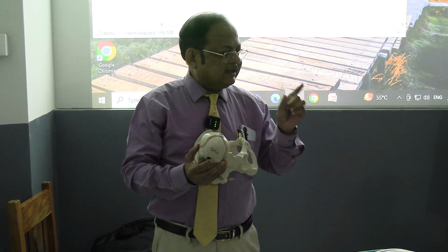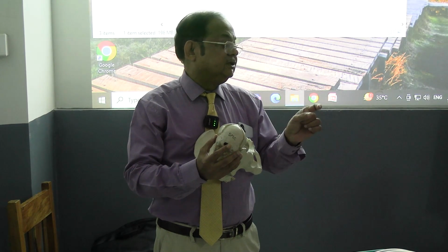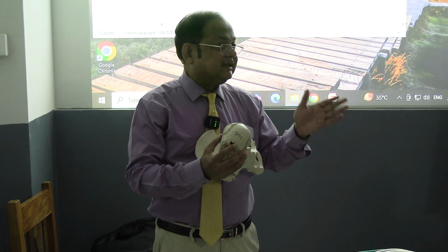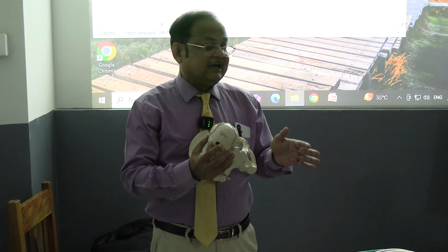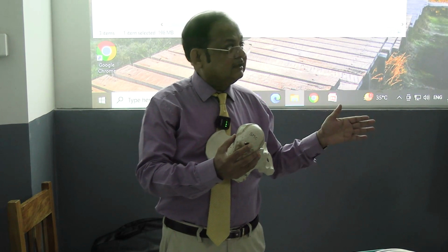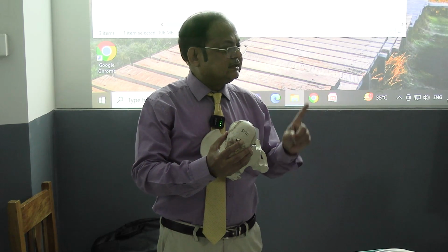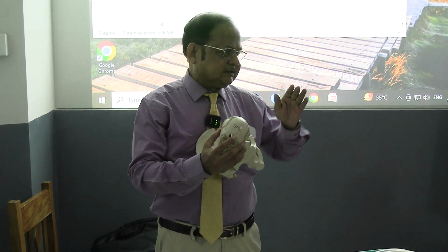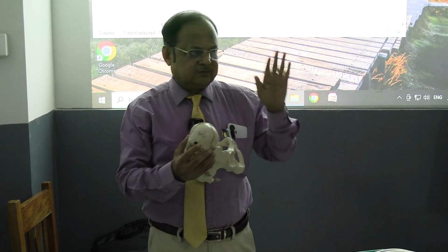When the forceps is applied at a station of 0 to plus 2 centimeters, that is called the mid forceps operation. Low forceps is below plus 2 centimeters but not on the perineum. Is the idea clear? This is the standard international classification by ACOG, the three types of forceps operation. It is also true for the ventouse.